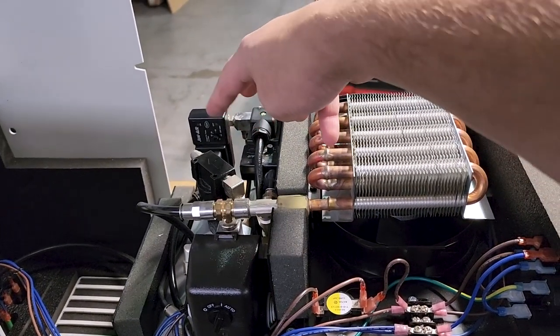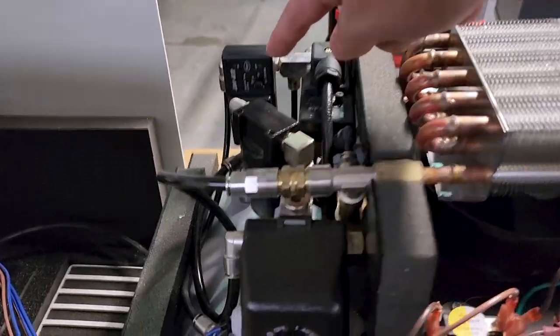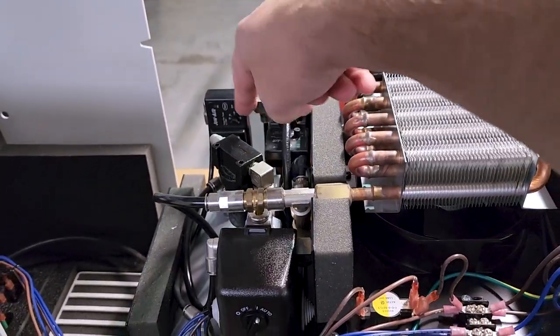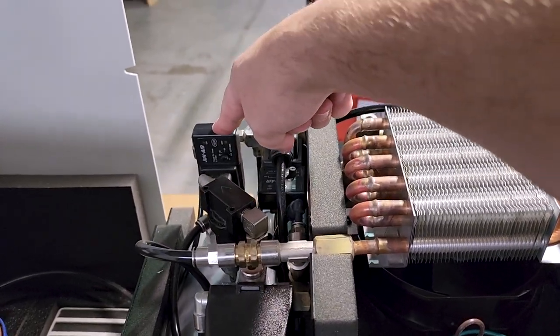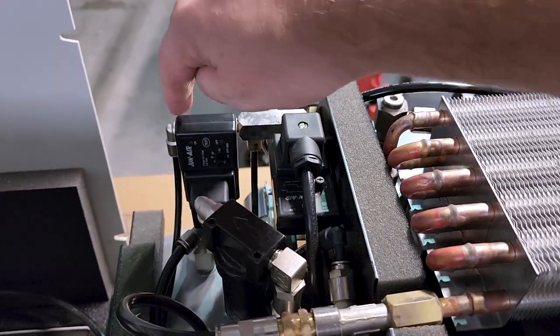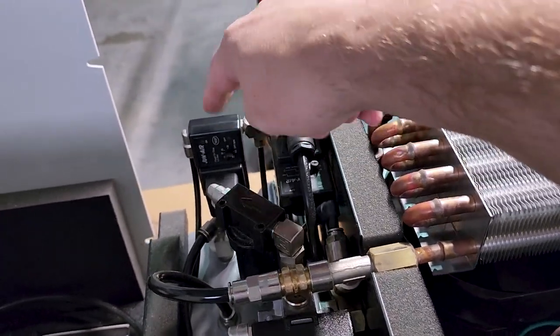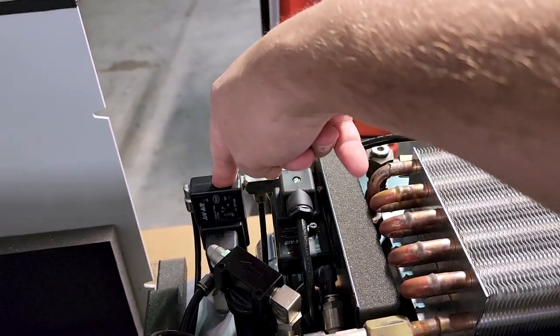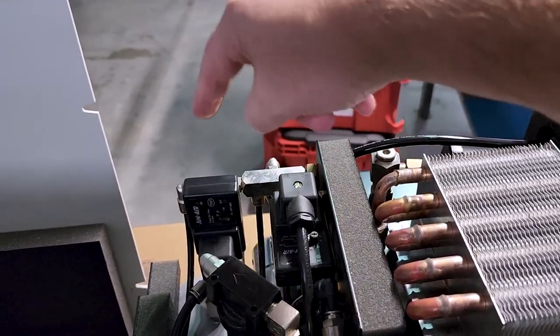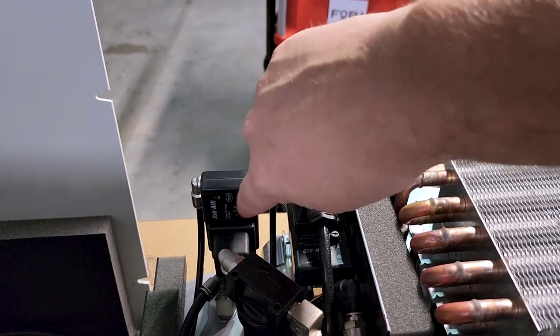These two valves right here, they will switch their positions. They have LED indicators, and you can adjust their on time. So if you want it to purge a little bit longer, if you're in a high humidity environment, you can actually turn this guy up. I don't know what the OEM says about that, but you can, because right there is the controls. So when it's energized, they'll switch from normally open to normally closed, or normally closed to normally open. You can adjust that, and you adjust their duration right here.